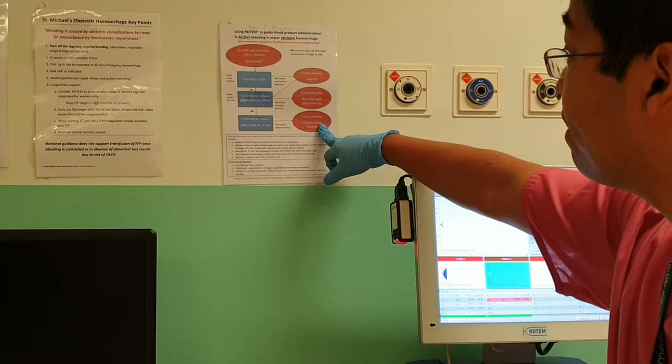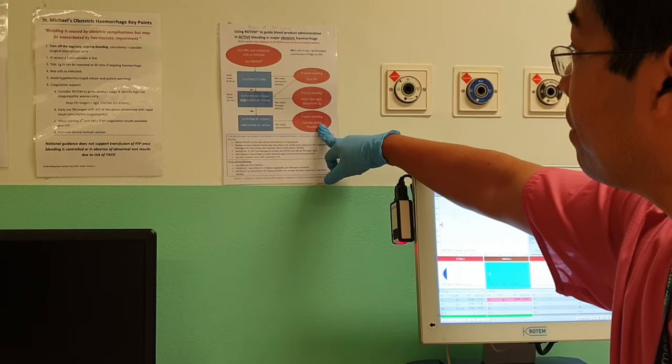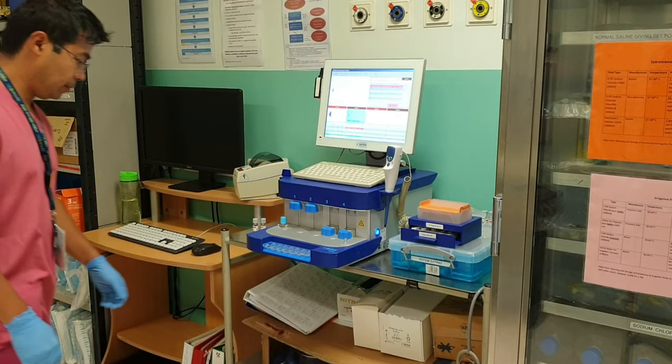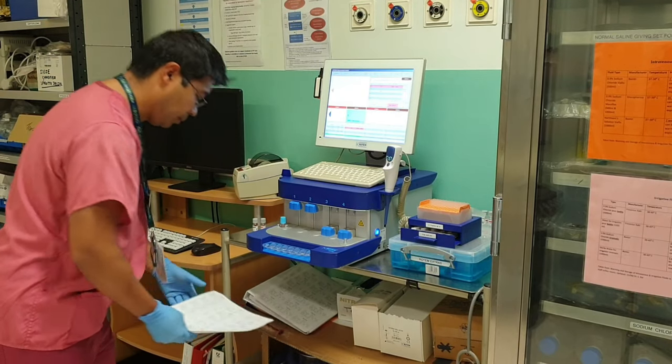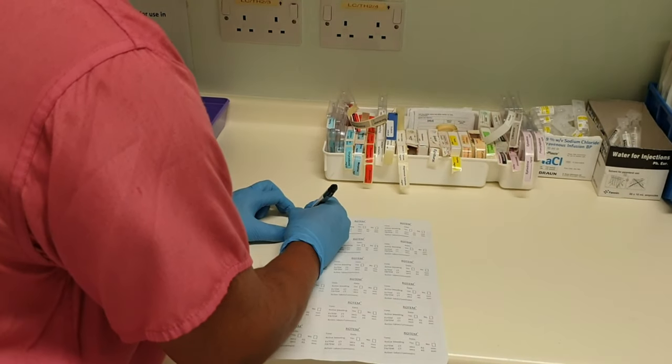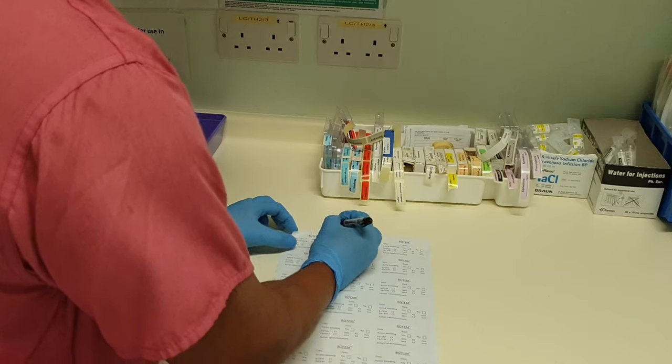The results can be assessed using the flowchart which is next to the machine. In order to make a record, it's good to get one of the stickers which should be underneath the machine, fill it out on the left, and when ready place it in the notes.